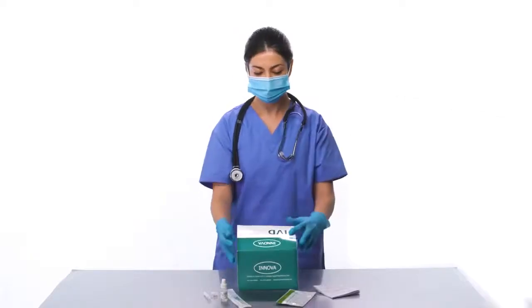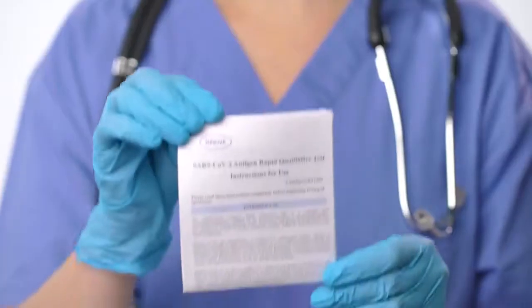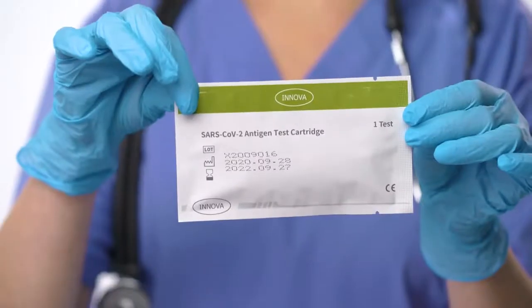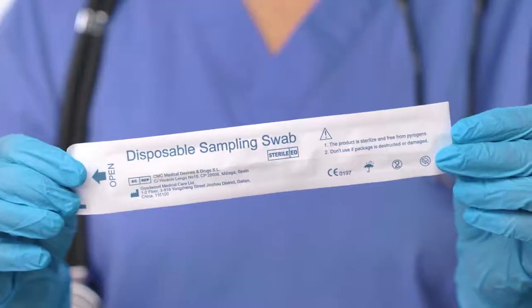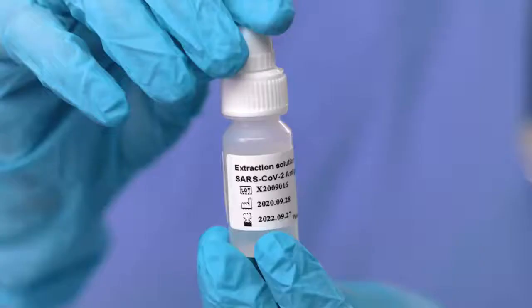Before administering the test, familiarize yourself with the components of the test. Each kit will include instructions, a test cartridge, collection swab, an extraction tube, cap, and buffer bottle.